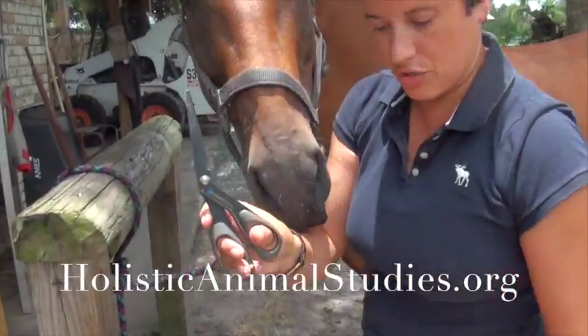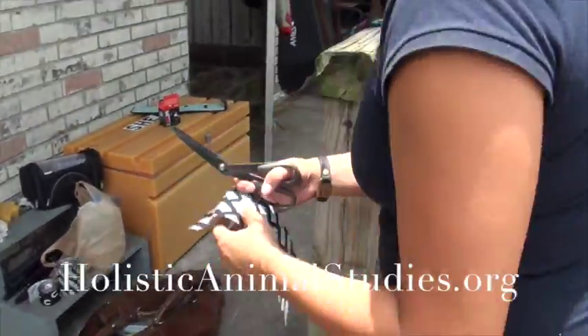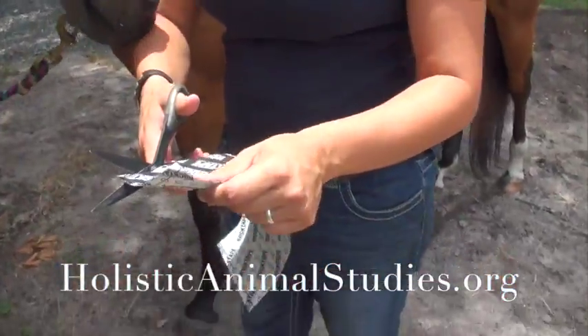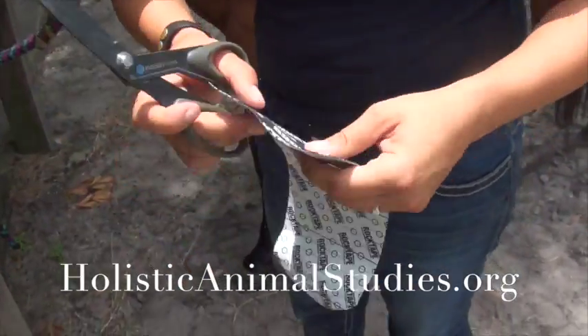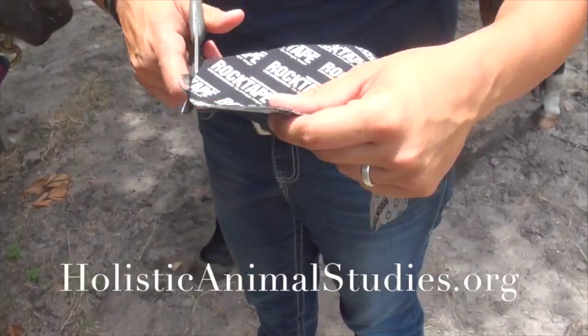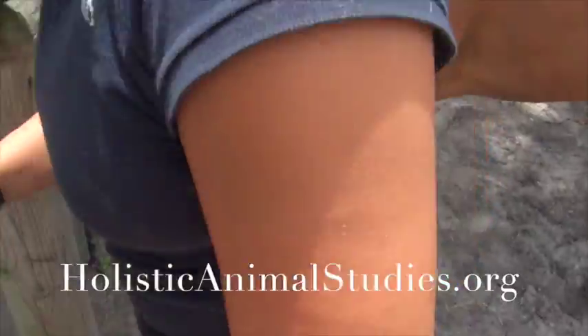Notice I have my non-stick scissors, which makes it easier to cut. I'm also going to round the edges just to make it look a little bit nicer and keep it from catching on anything — like if we put a blanket on her, we don't want it to catch as we're pulling it over her head.